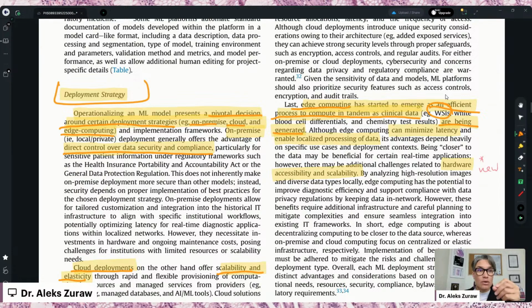They don't call it quality control, they call it quality assurance, because if you do it while you're scanning and do something before anybody sees the scan, you assure quality. When you do quality control, they say, you've already generated something that was not good quality, so you add work. They call it quality assurance, and you can do it while generating your data.